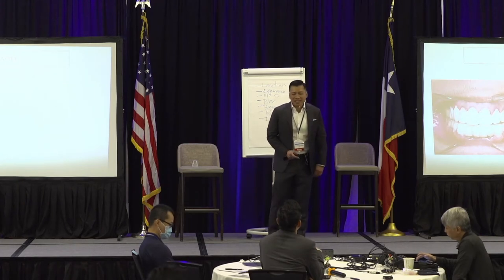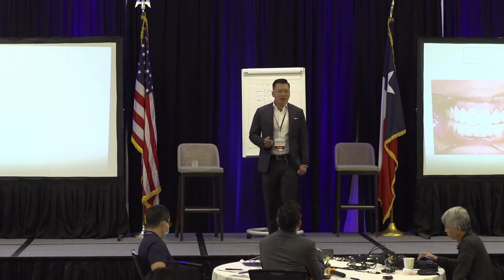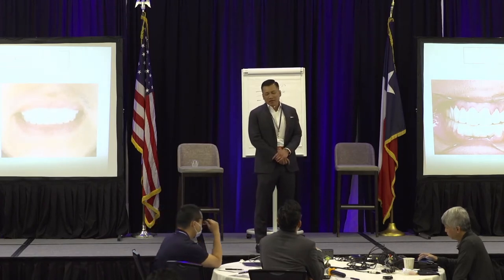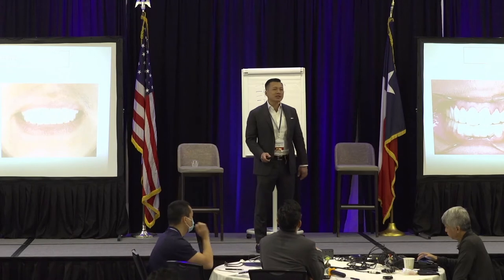This was kind of what he did, prep and pray. You can see his little open bite there. That's the before and the after. So it's not perfect, but I'm going to show you how to make this a lot better through our digital workflow.